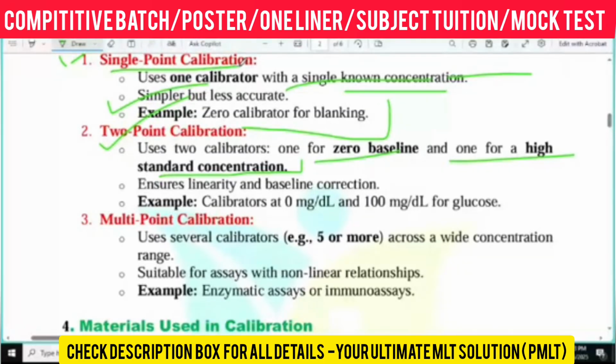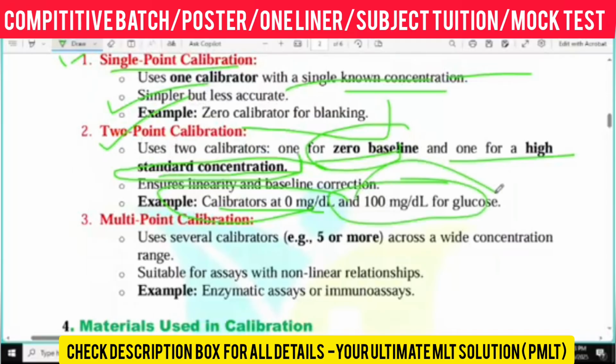If you are using two calibrators, one for zero baseline and another for the high standard concentration, that is called two-point calibration. As an example, for a glucose calibrator, you use 0 milligram per deciliter as the zero baseline and 100 milligram per deciliter, because that is a high standard amount, right?